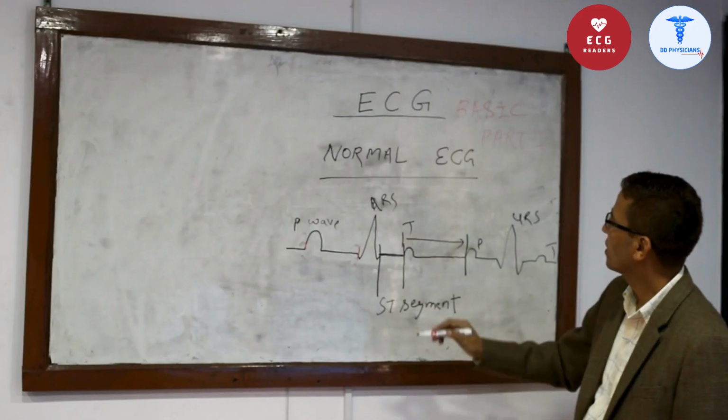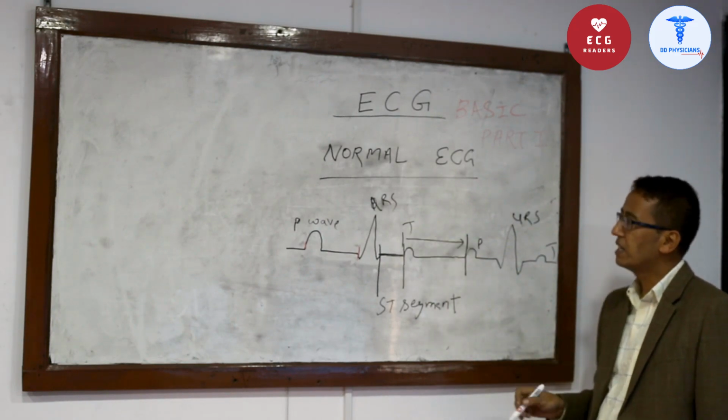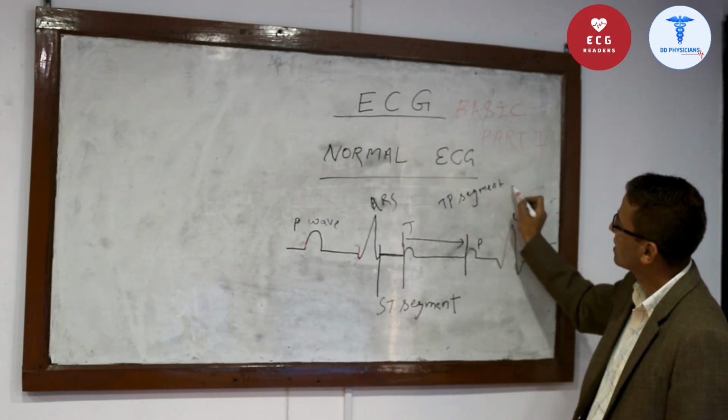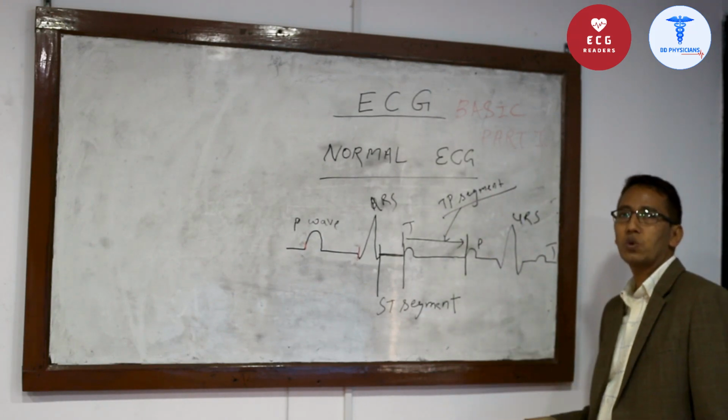Actually, this TP segment is also called the isoelectric line.